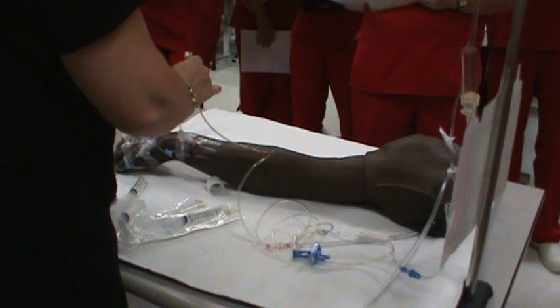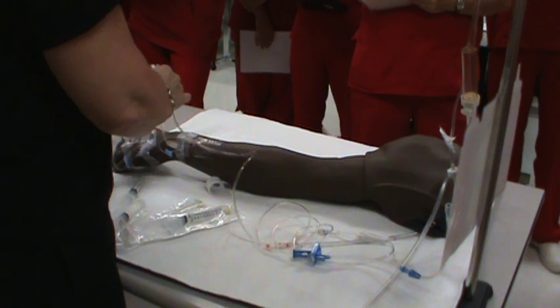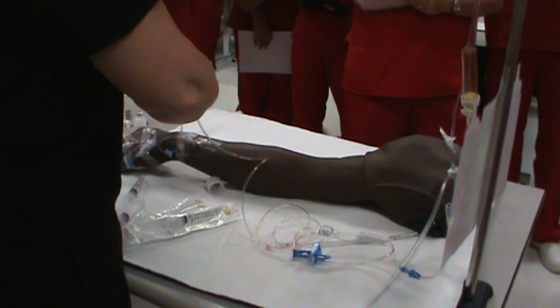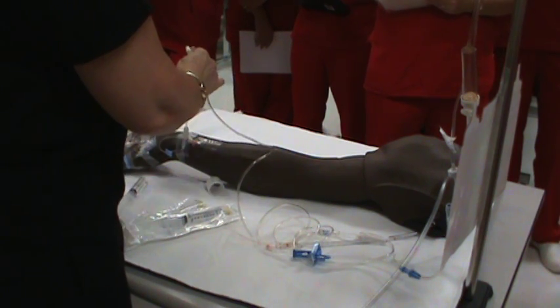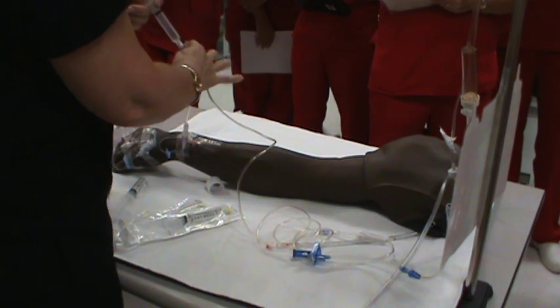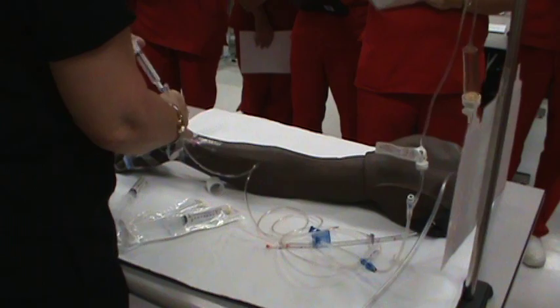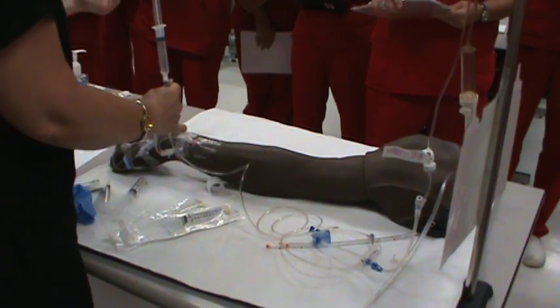And then you give your bolus, right? There's your bolus over what rate? Same rate it was delivered. Okay, 30 seconds, 10 mLs again, same rate, okay? All this is stopped, the roller clamp is clamped, you're looking at your line, talking to Mr. Davis. How you doing? Watching him, is he turning blue, is he not breathing?